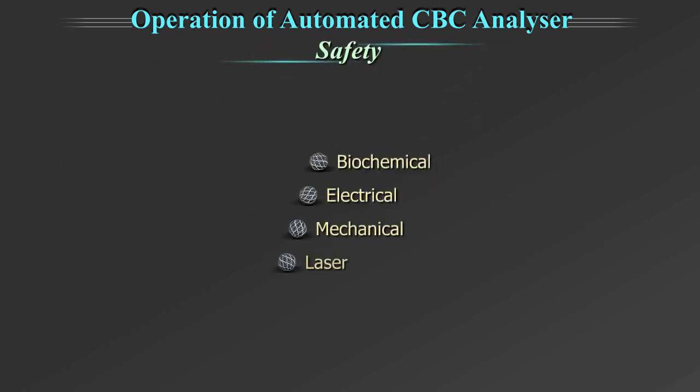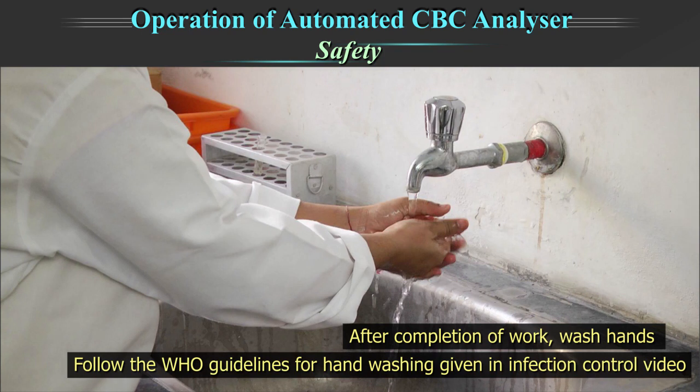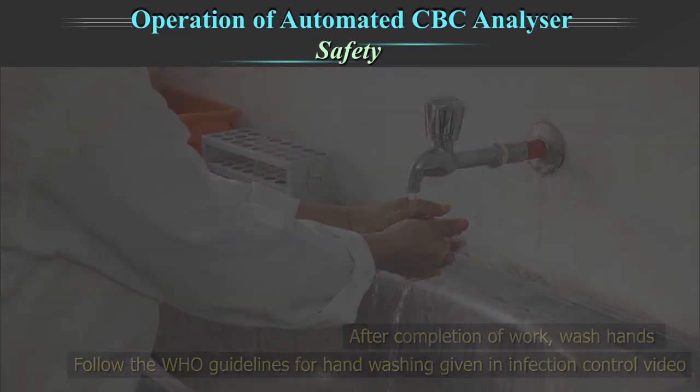Safety. Always wear personal protective equipment and gloves when processing with the instrument and during maintenance. After completion of work, wash hands. There is danger of contracting infection from an infectious sample or the control sample.